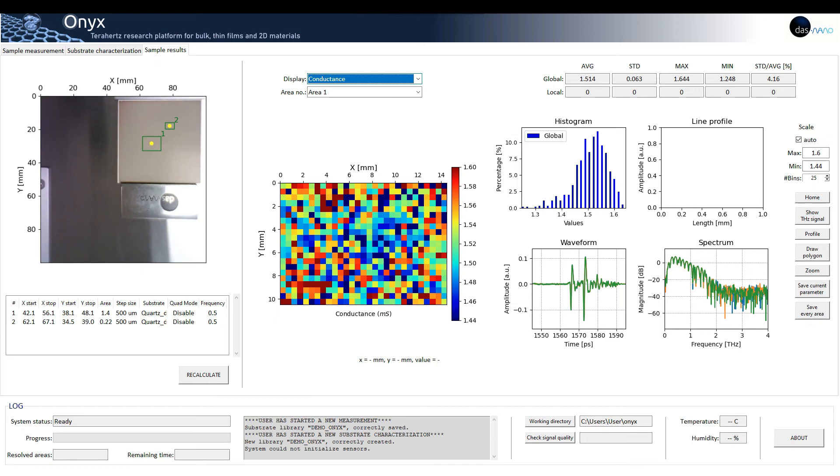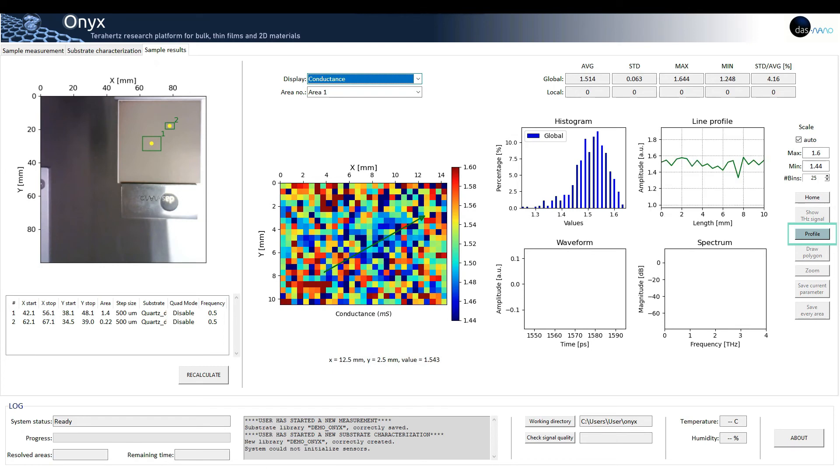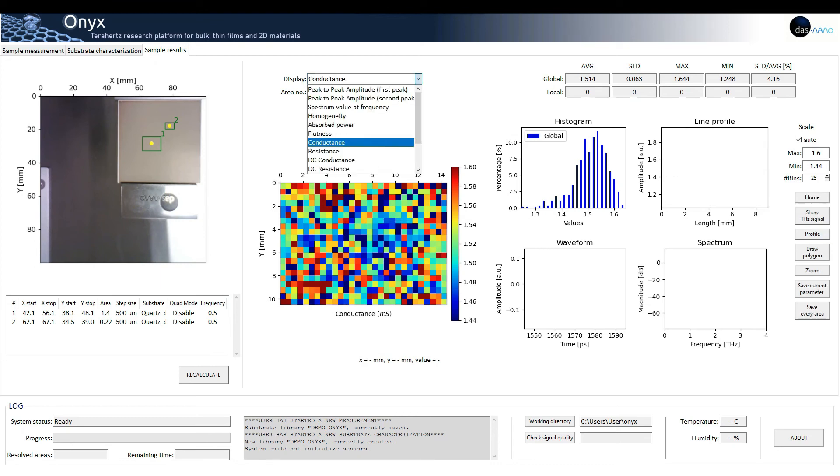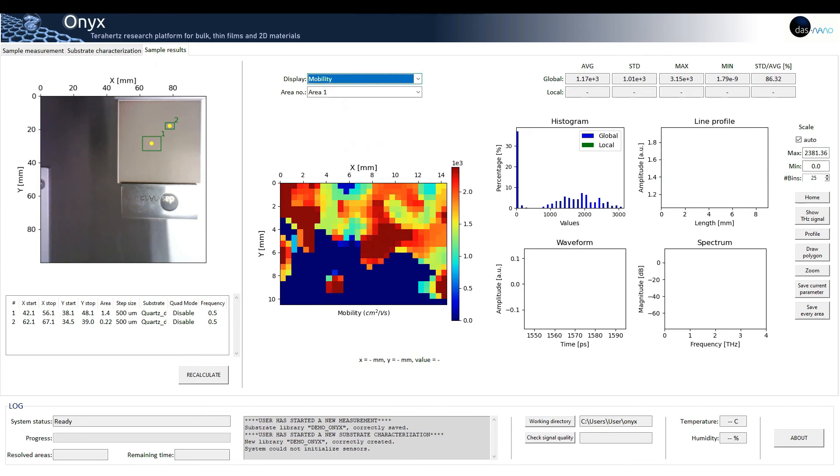A line profile can also be depicted by clicking on the profile button. This functionality is useful if the user wants to identify trends and see the homogeneity of their samples, since at a glance you can see the variation of each parameter along a straight line.